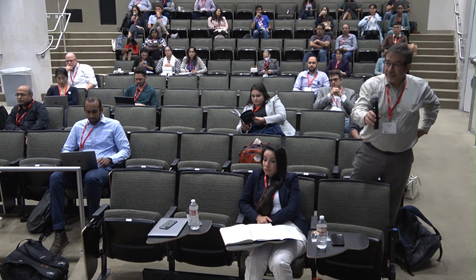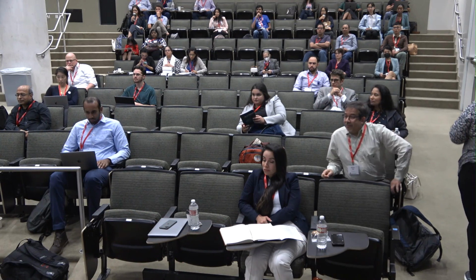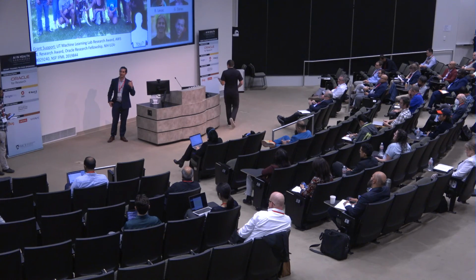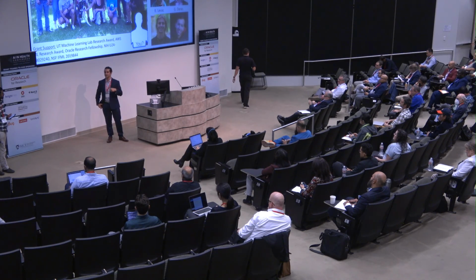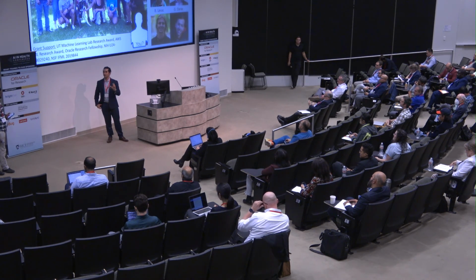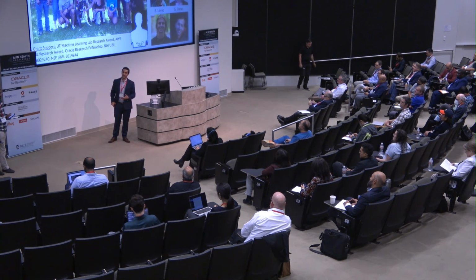Yeah, that's a good question. The question is kind of a technical detail. I actually didn't mention that we're dealing with Gaussian noise, but you're right, we are. If you're dealing with a different kind of noise model, then you just have to bake that into the posterior. That's what's nice, that we're decoupling the measurement model from the image prior. So we would train the image prior in the same way, but P of X given Y would decouple into a likelihood term that would change. And so it can handle different types of noise distributions.